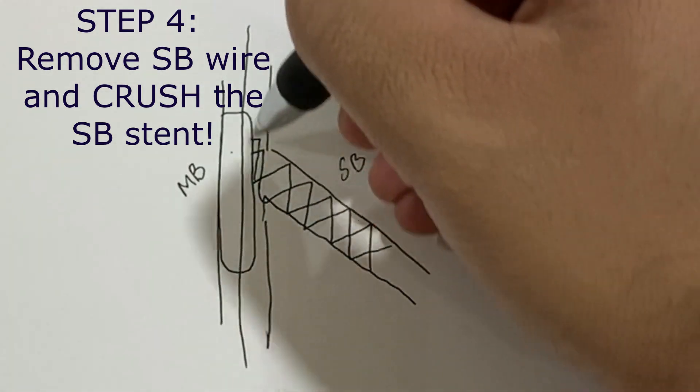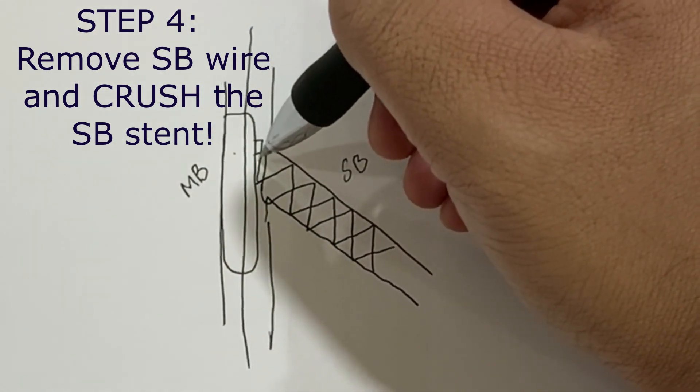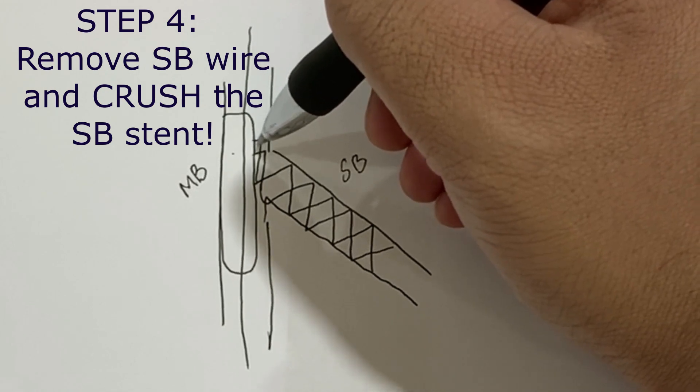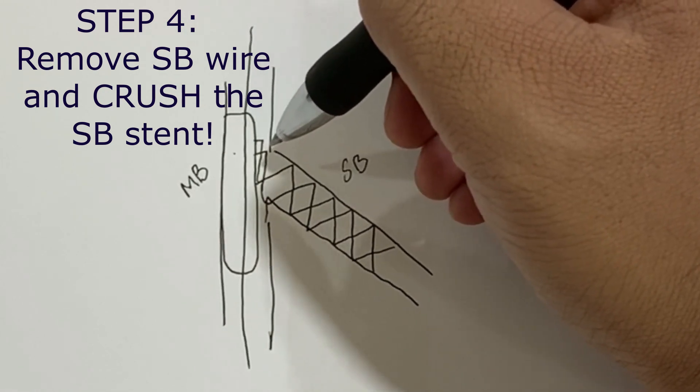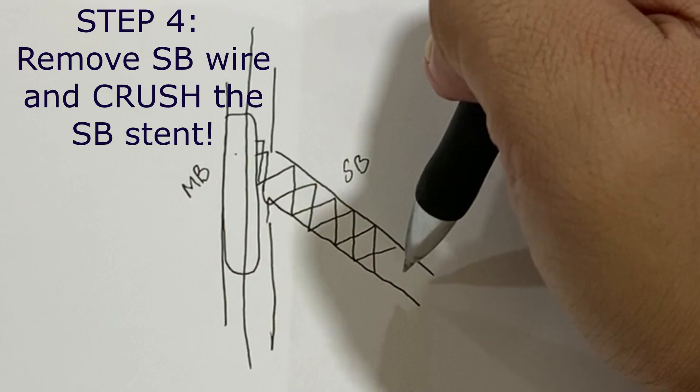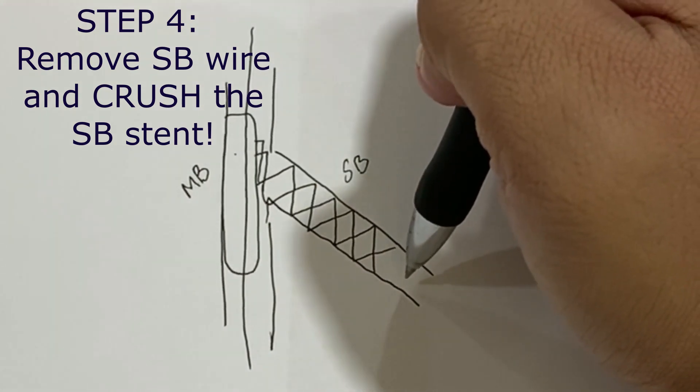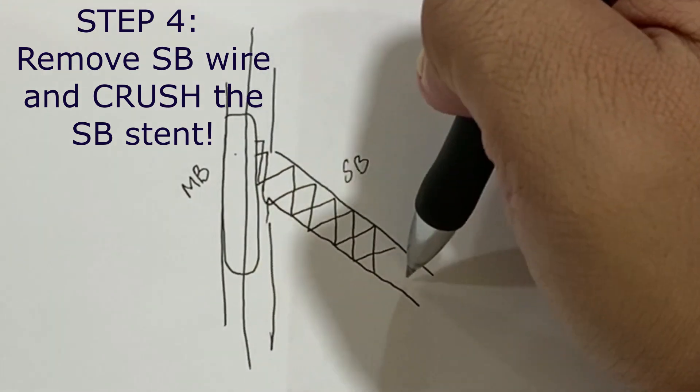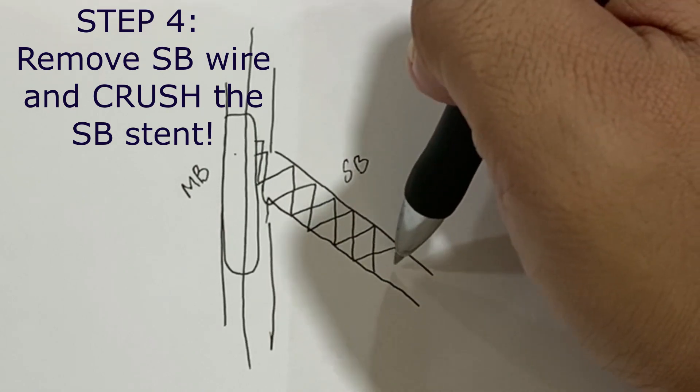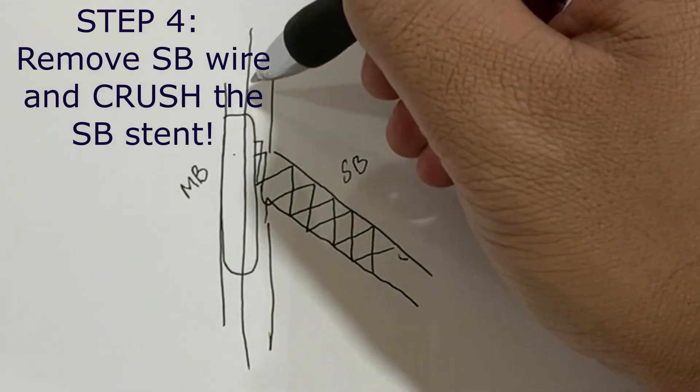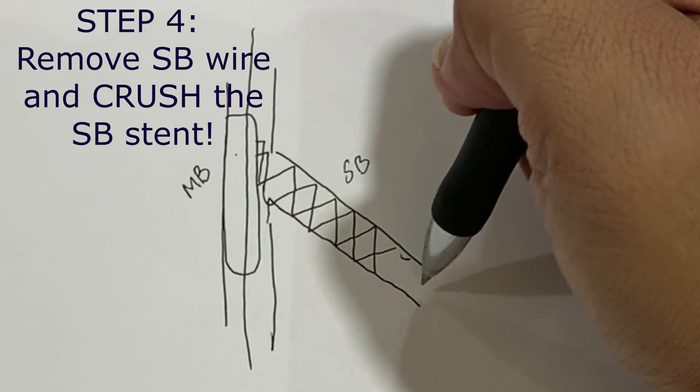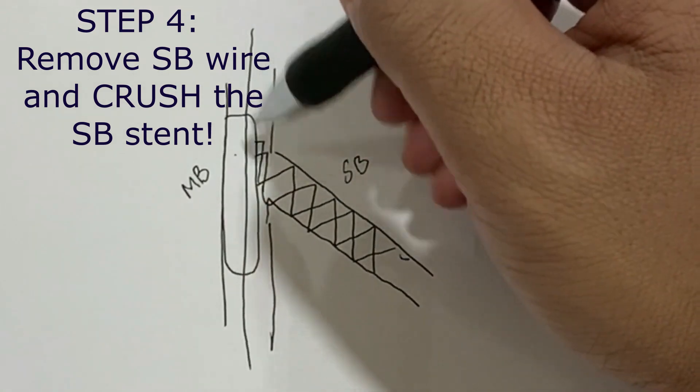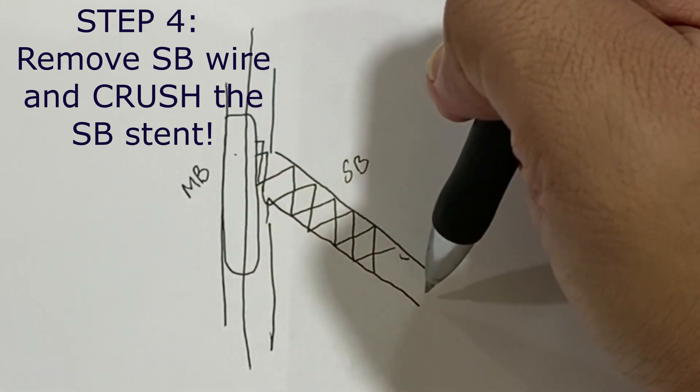Once this side is crushed, you remove the main branch balloon. It is extremely important to remove the wire when you are crushing this stent because the wire can get stuck in these struts. It is also important to look at and take an angiogram before crushing this stent. If there's any dissection in this area, you should cover that with another stent prior to crushing this stent because then it will be very difficult to get the balloon or the stent in that place.